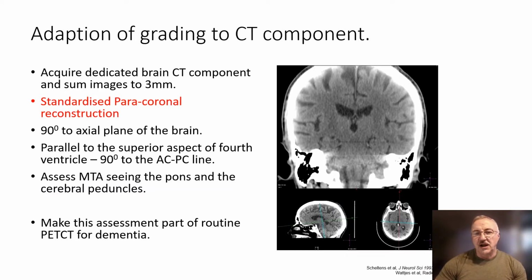If we acquire high isovolumetric, high mAs, high quality CT component, then we can make these grading assessments as part of our normal practice. This is very useful, often in confirming a pattern of AD, in confirming an asymmetric pattern of AD, and sometimes in helping us to exclude AD as an imaging differential diagnosis in certain patients.